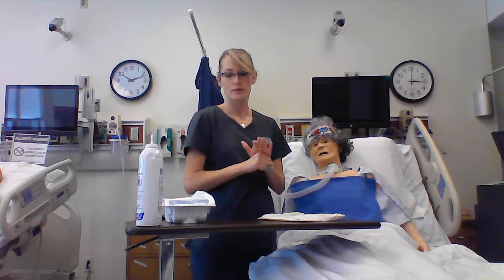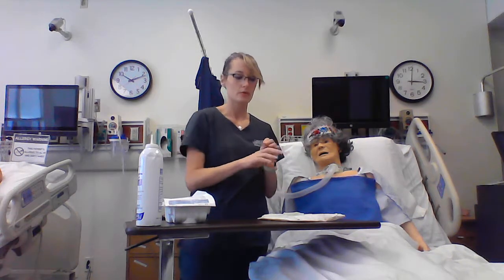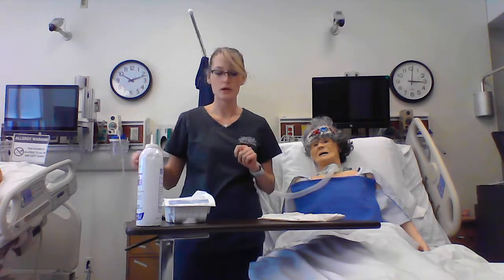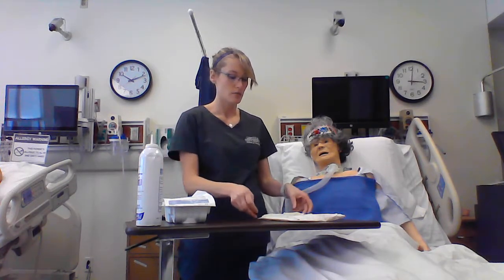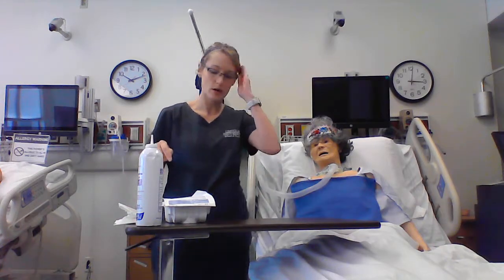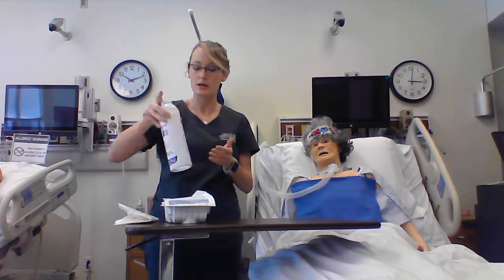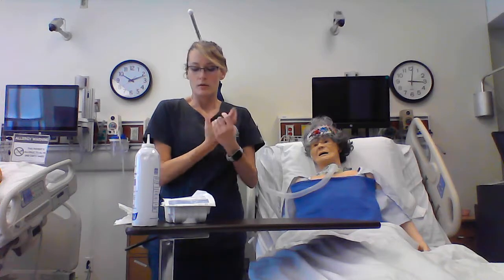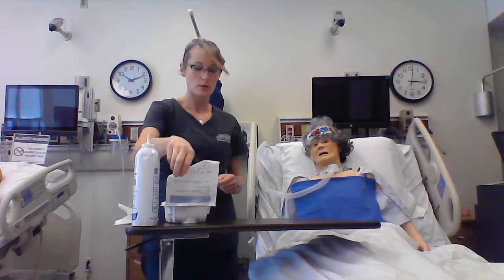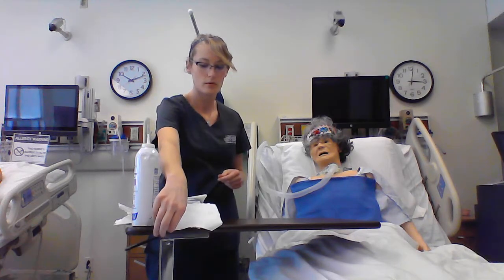But I forgot to open my trach kit first. So I would throw these away. I've already touched them. I'm afraid they're contaminated. So I would throw them away, get a new set. So go ahead. I would go get a new set of these. You need to open this trach kit first. So I'm going to go ahead and perform hand hygiene again. And then open your trach kit first. My apologies. Open this trach kit away from you.